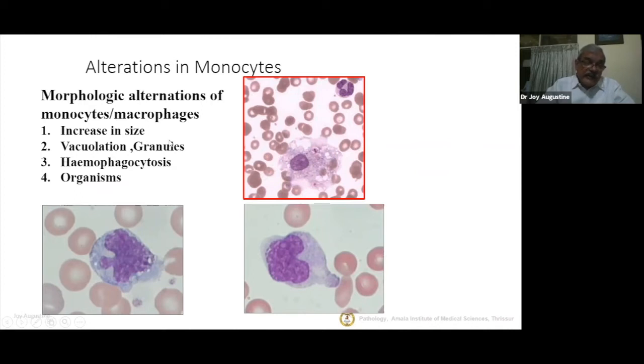So much so that certain cell counters actually measure this, and it's put as neutrophil distribution width and monocyte distribution width, NDW and MDW, and this is considered to be a pointer to sepsis. And I think in some of the analyzers it is already validated and available.